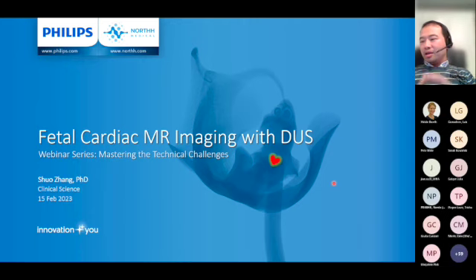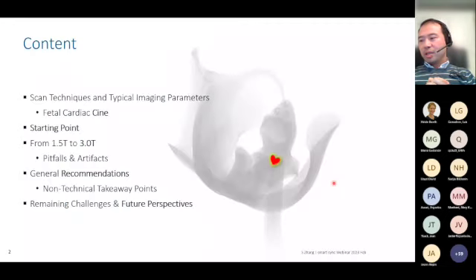Excellent. Good morning, good afternoon, and good evening, depending on where you are. This is Shu Zhang speaking from Philips, today from Germany. And I'm happy to share some of the learnings on this topic. So after going through the clinical applications and impact of using the ultrasound gating device from Luis, I think it's actually a good time to step back now and look from the technical angle to see if and how we can further improve the fetal cardiac exam.